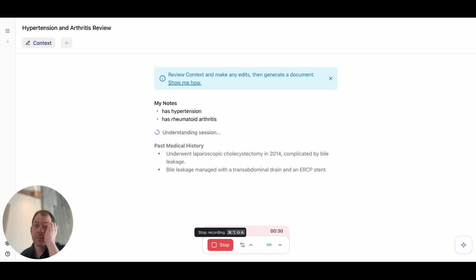Okay. Does this pain remind you of any pain you've experienced before? Yeah, it felt like exactly when I had gallstones, but I had my gallbladder removed. Okay. All right, I'd like to examine you. And I'm going to talk to the machine now. I can see the abdomen is not distended, and there are some small scars after laparoscopic surgery. And there is no tenderness and no palpable masses, no hernias.